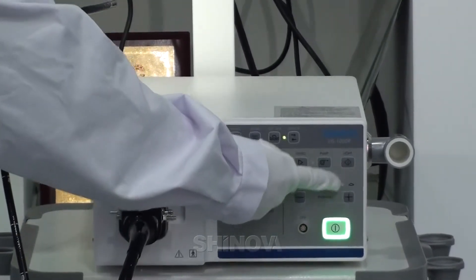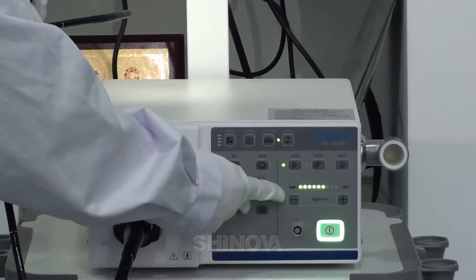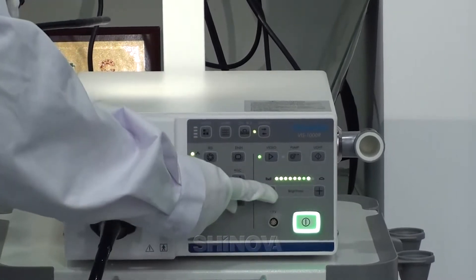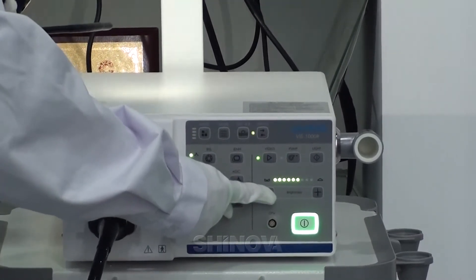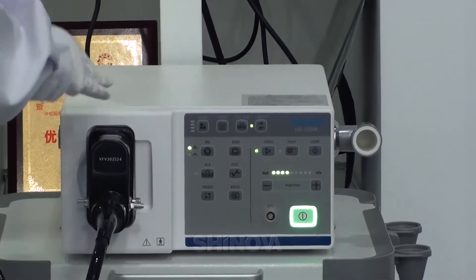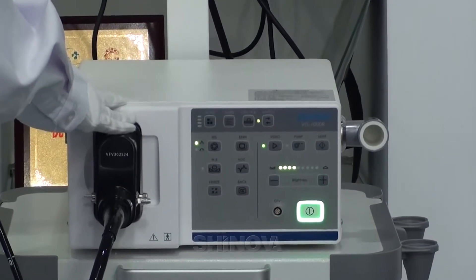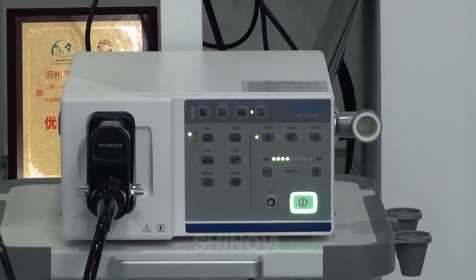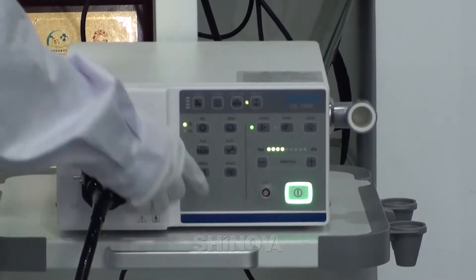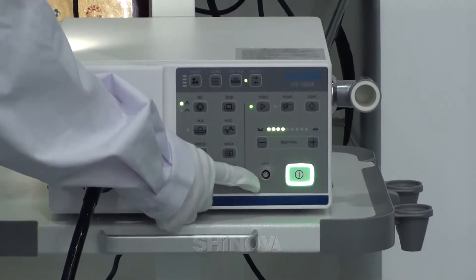This one is the light. We have nine level lights. You can increase it. For this processor, you can connect it to the rigid and flexible Innoscope. When you need to connect the rigid Innoscope, you can connect the camera head from here.